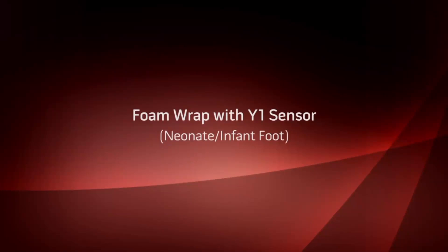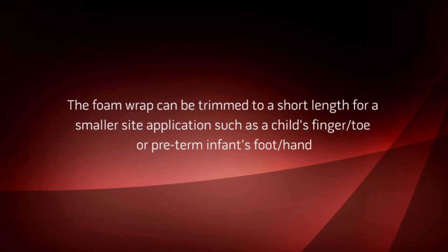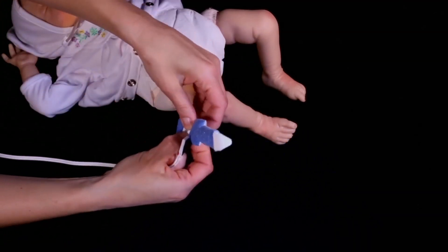Apply the Y1 sensor to the foot of a neonate or infant. The foam wrap can be trimmed to a shorter length for smaller site applications such as a child's finger or toe, or a preterm infant's foot or hand. Push the button on the emitter sensor pad through the hole on the left, and the remaining button on the detector sensor pad through the hole on the right.